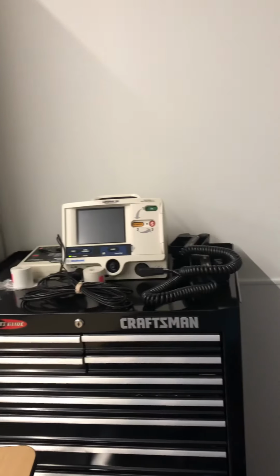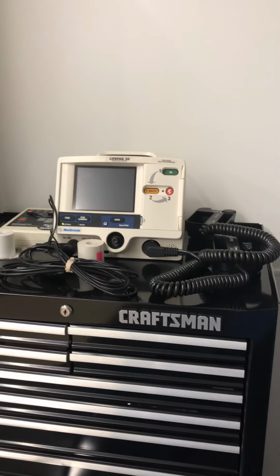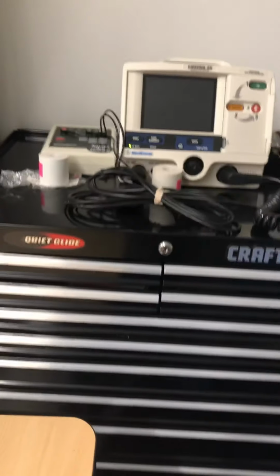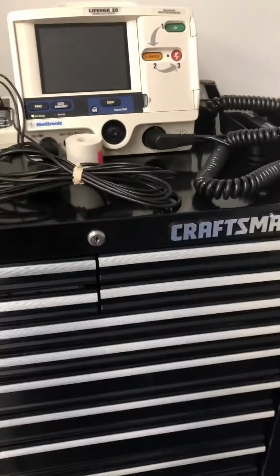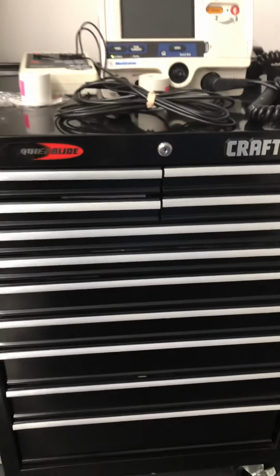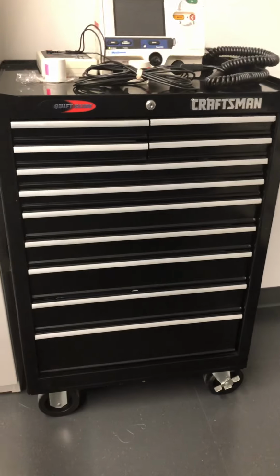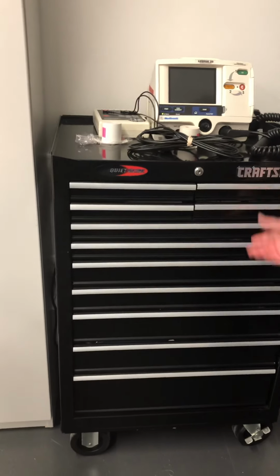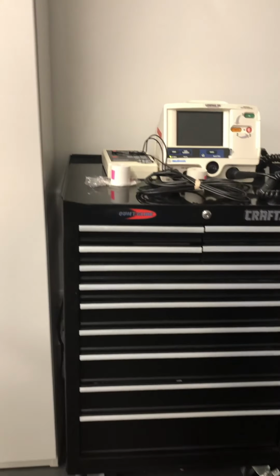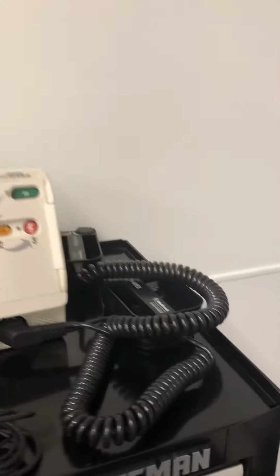You're looking right now at a crash cart or a code cart. We have a machine on the top where it can be hooked up to a patient, and you could see their EKG tracing, their heart tracing. And then in each of the drawers, there's equipment for if you needed to do a code. If there was some reason their heart had stopped or they were having trouble, and it's locked apparently, which is a good thing. You really shouldn't have a code cart open. There should be a way to unlock it. So we're prepared so that students can learn how to do this kind of care.